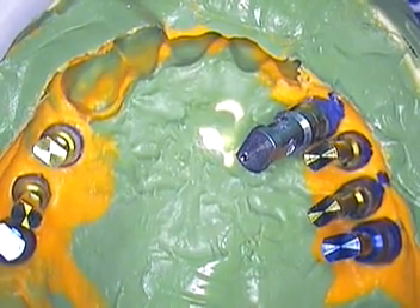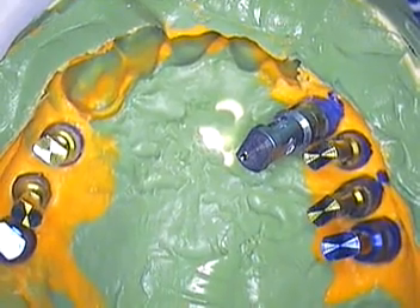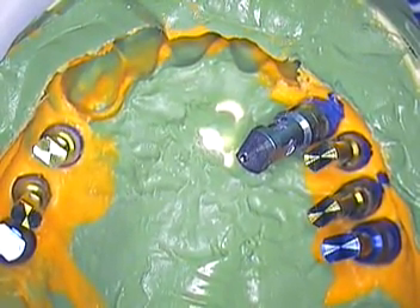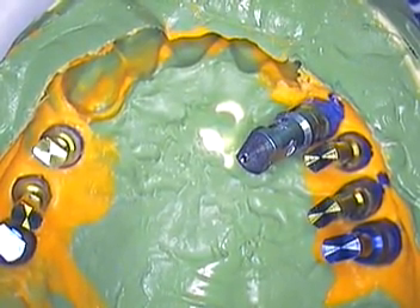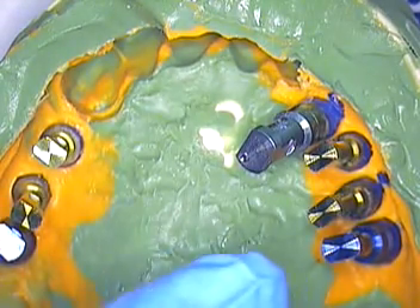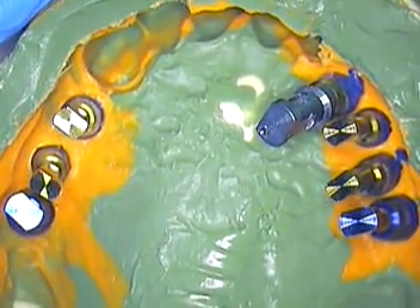The patient has been wearing an upper partial denture for many years and prematurely lost tooth number 6, the cuspid. He lost a lot of buccal bone and the surgeon placed a 6.0 Nobel BioCare implant in that area. After he had his sinus surgery and sinus grafts, the surgeon then placed a series of Nobel implants — these are Nobel Selects on the maxillary right and left side. So there are 7 implants total.